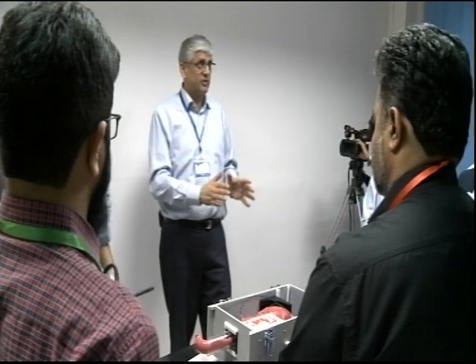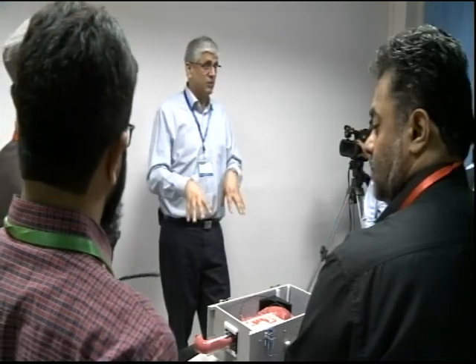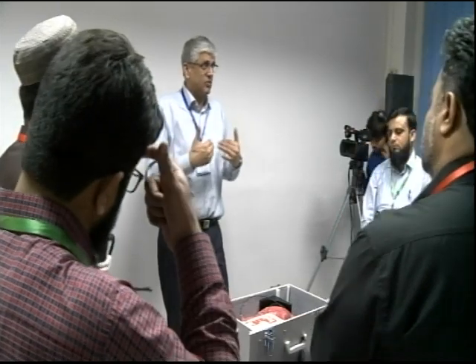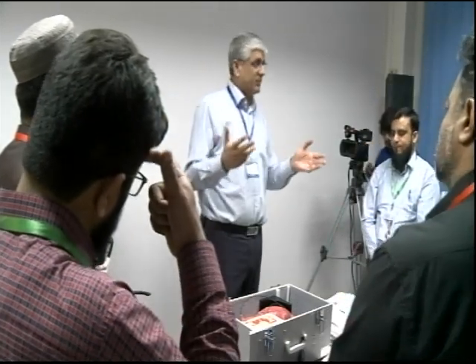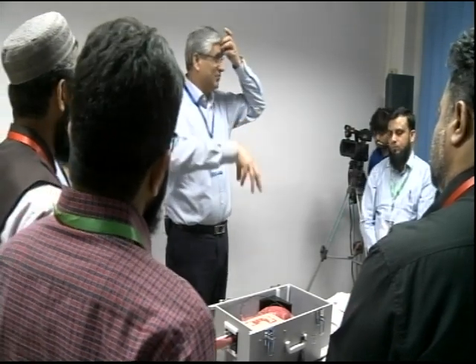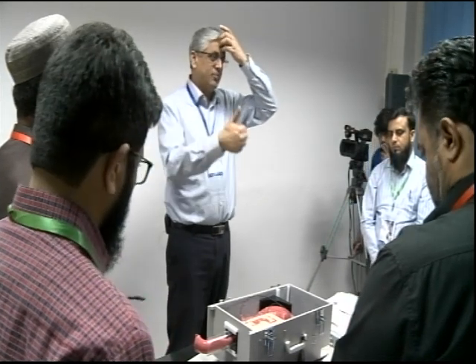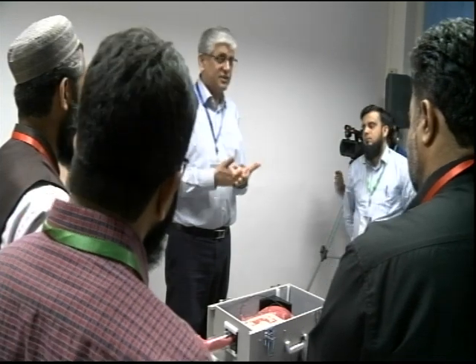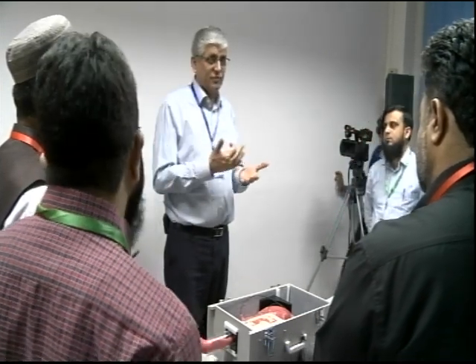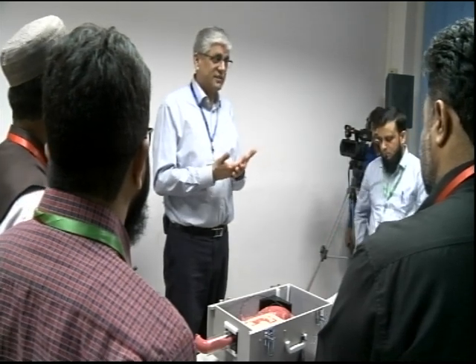And we now tell the anesthetist that it is your responsibility to ensure whatever you need is in the unit, in that room. It's not our responsibility. We don't know what you need. It's their department, and we don't have an anesthesia department directly involved here. They're just doing us a favor. So it becomes difficult. So that's important if you're using conscious sedation: make sure that you have flumazenil or naloxone available to reverse in case.